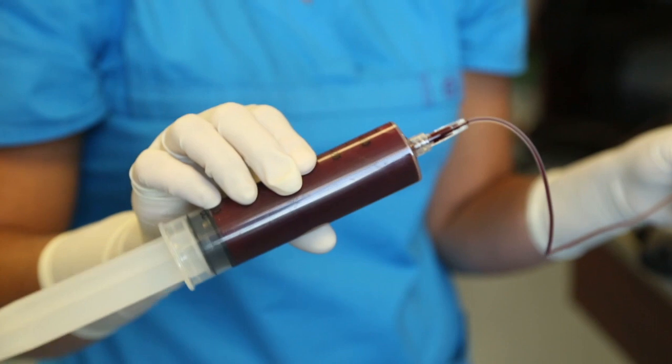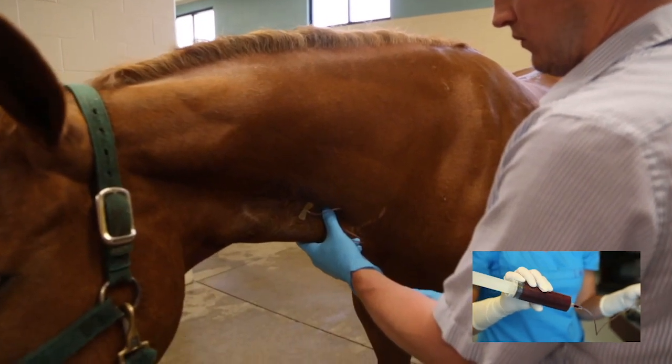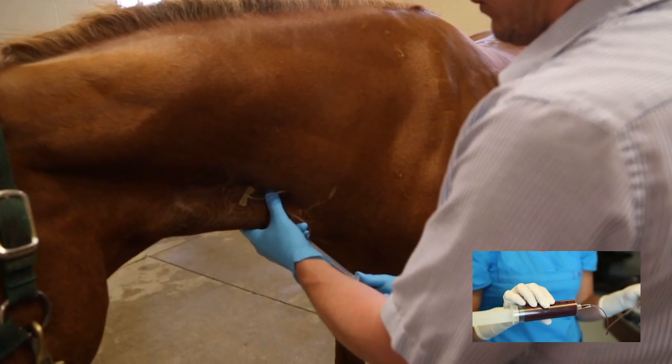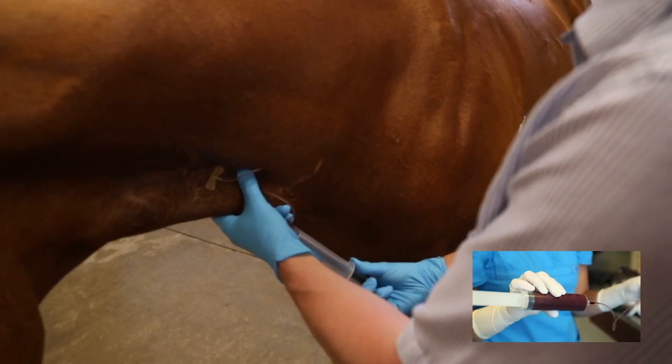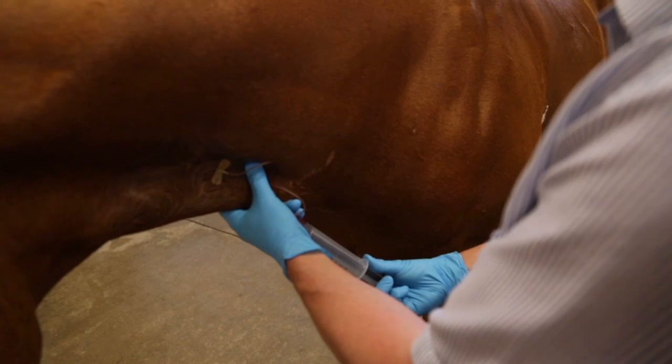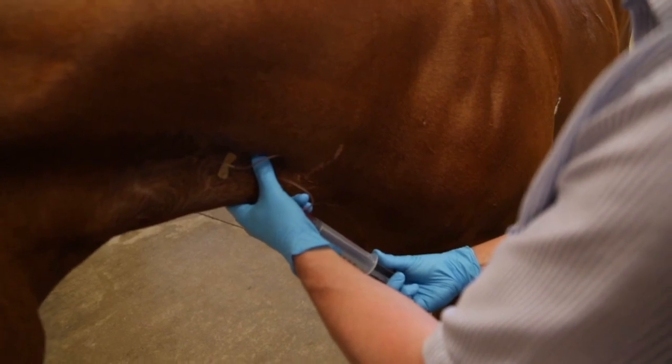An 18 or 19 gauge apheresis needle set is recommended to minimize the risk of damage to the platelets and cells and will make it easier to invert the syringe during the blood draw. Take note of the total volume in the syringe in consideration of the appropriate counterbalance weight during centrifugation.